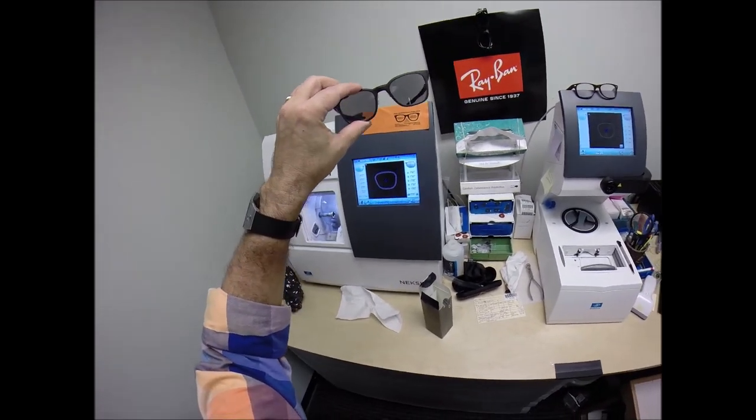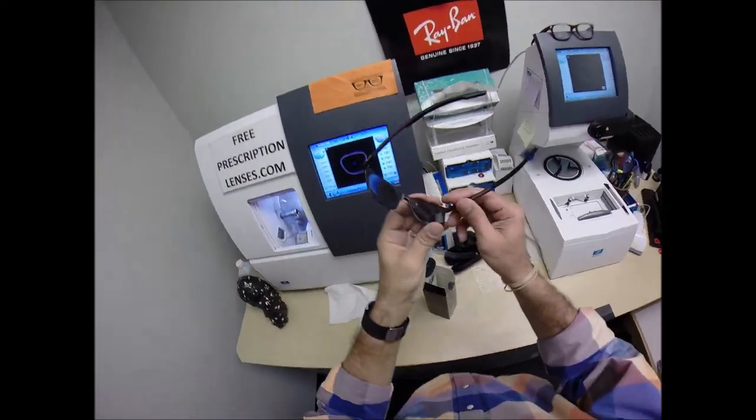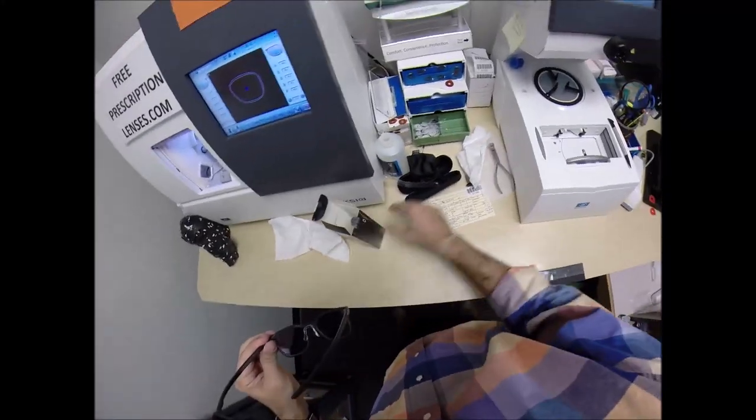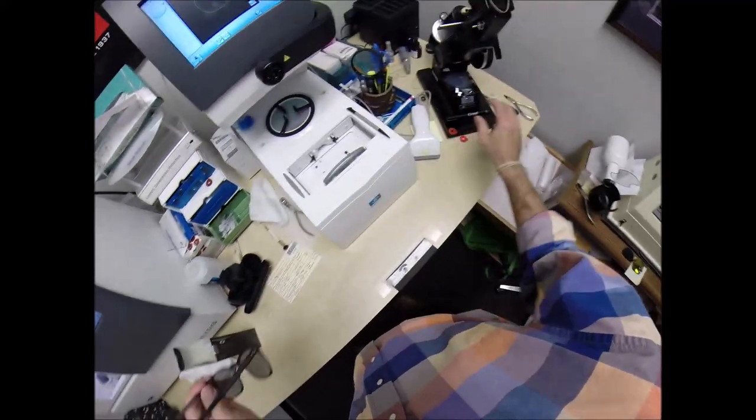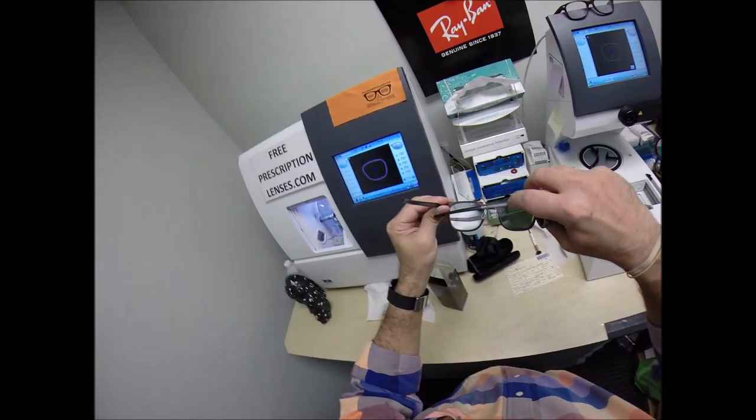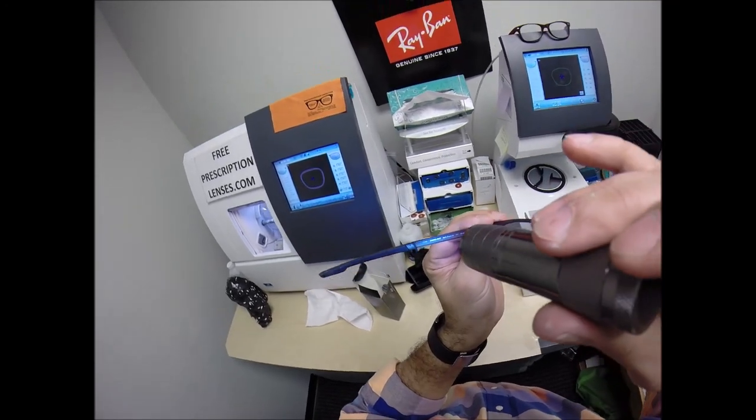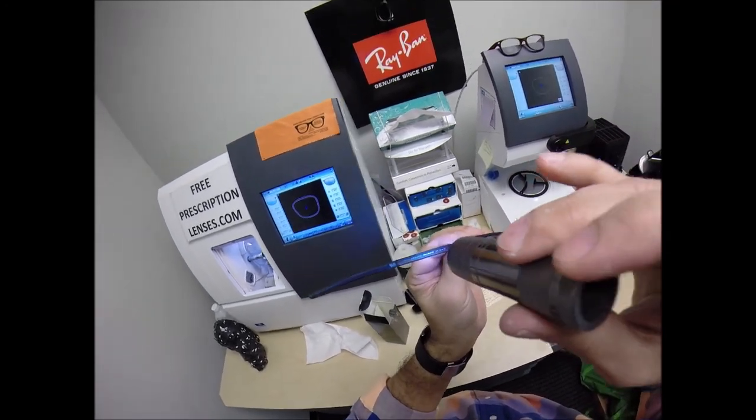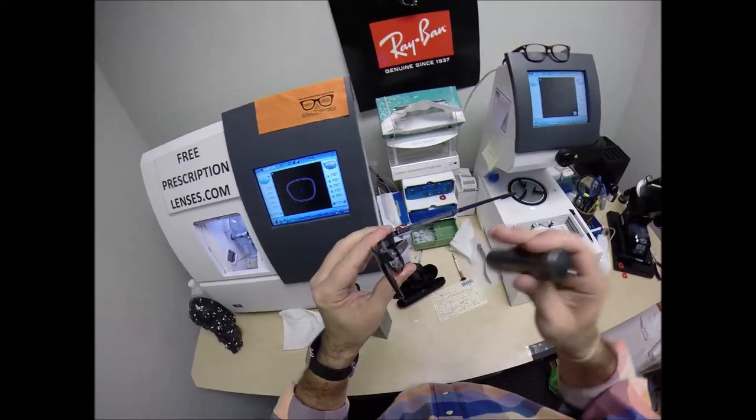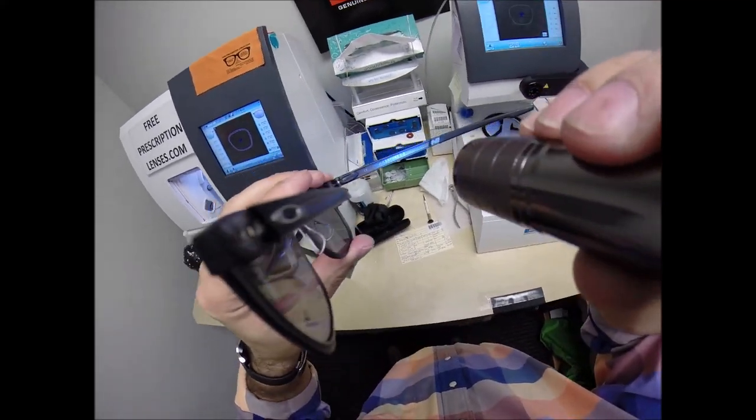So Jim and Fargo, North Dakota, I hope you enjoyed watching as I cut your invisible bifocal, your Essilor Ideal Advance with Transitions Gray for your Oakley 8093, color 02, which is the matte black ink in the 49 eye size. Again, this also is known as the Milestone 3.0.